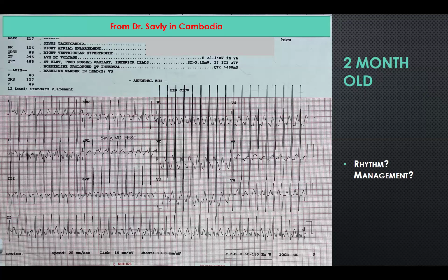And actually, Leo Lieberman and I did a study many years ago when the present defibrillators that we have are called biphasic defibrillators. It has to do with the manner in which the energy is delivered. This was a major innovation over the prior technology, which needed much higher energy. So biphasic defibrillators have become the standard because they are more effective at delivering the energy to cardiovert somebody successfully. And we determined that for most forms of SVT, I think 0.4 joules per kilo was successful, but I would agree, 0.5 to 1 joule per kilo.